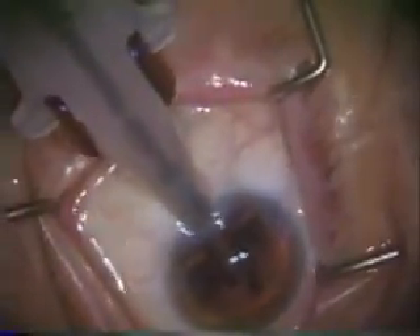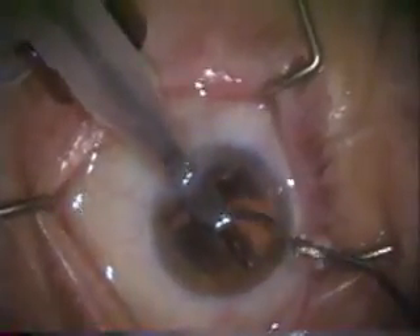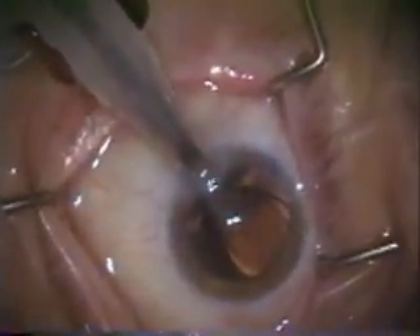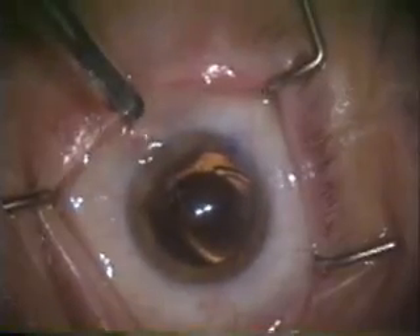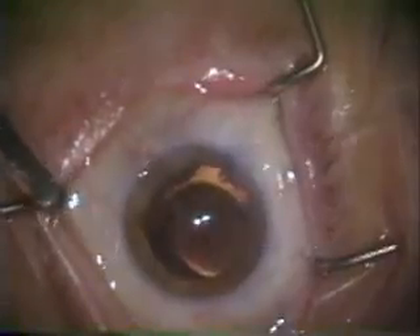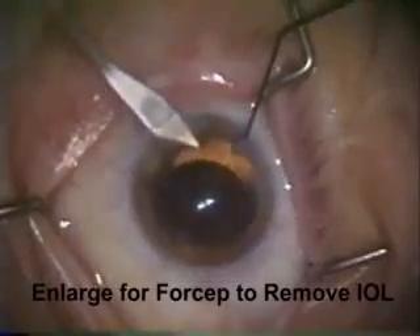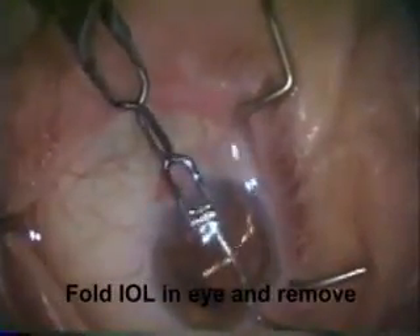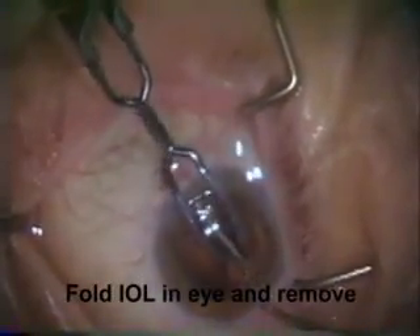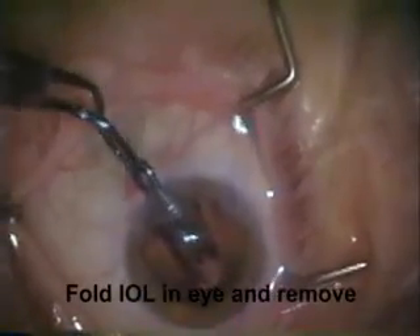Watch here — as this lens is inserted, there's a problem with the trailing haptic. It's come off. You can see the haptic is still in the plunger and yet the intraocular lens is mostly in the eye. Now we have a tough situation — we have to remove this lens. We're going to make the incision a little wider to allow a forcep in the eye, make a paracentesis across from the incision, and use a Beaver spatula to refold the intraocular lens into the forcep and then remove it from the eye, and then place another lens which is not damaged.